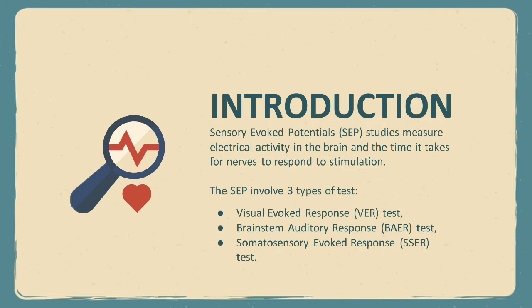Sensory evoked potential studies measure electrical activity in the brain and the time it takes for nerves to respond to stimulation. The size of the response is also measured. Nerves from different areas of the body may be tested.